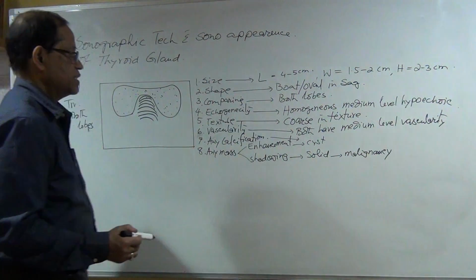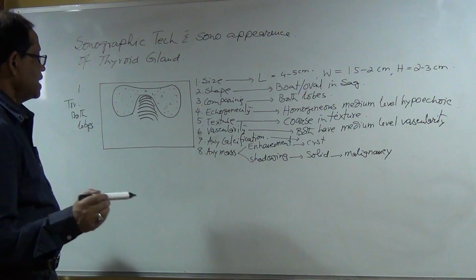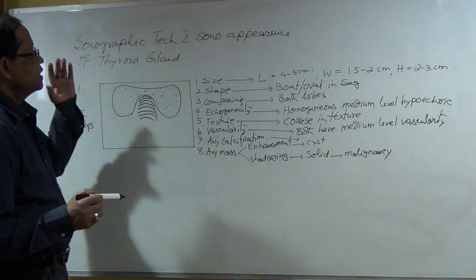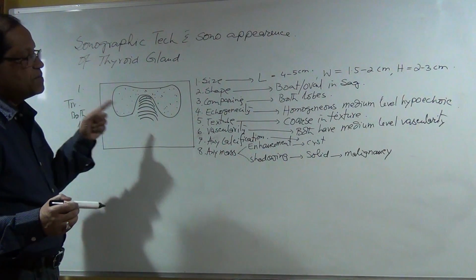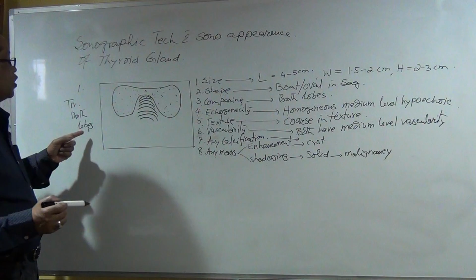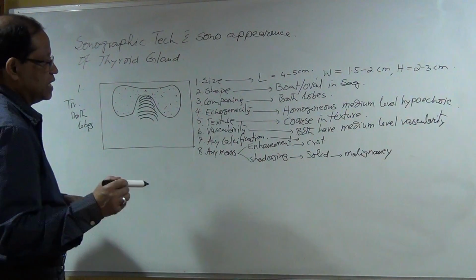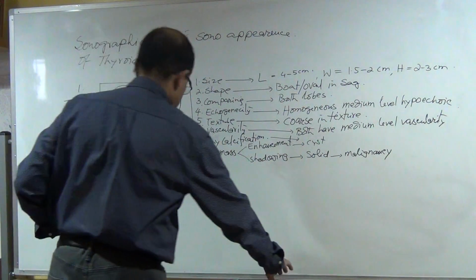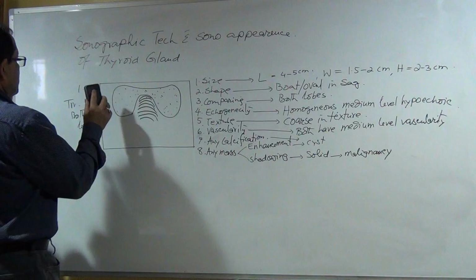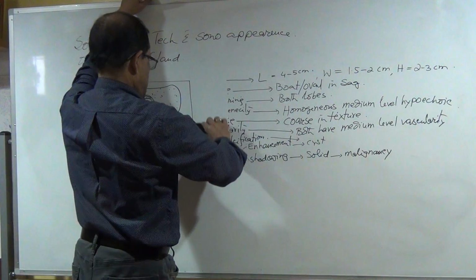Okay, so these are the things we need to keep in mind during the total protocol. And you have to take this image, transverse both lobe without color, and next one is with color. So make sure you understand all those things. So now let me give you the rest of the protocols.